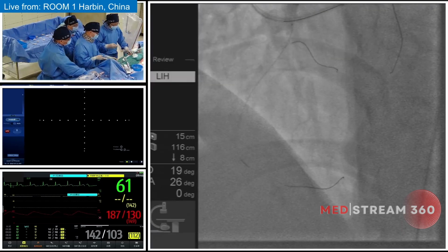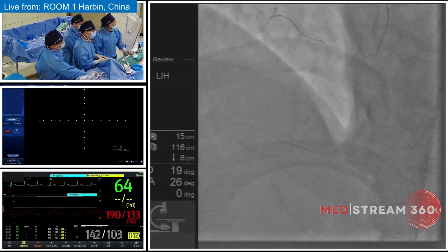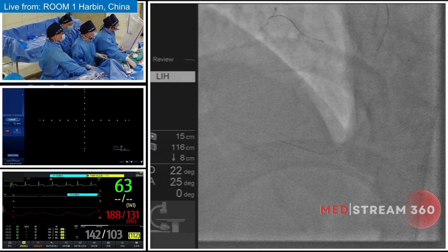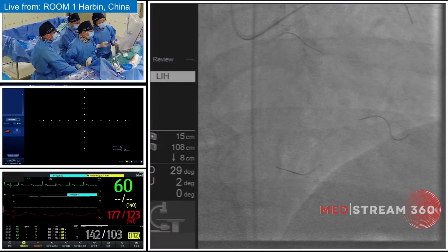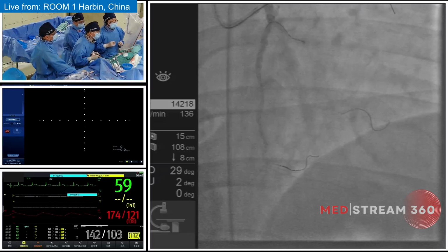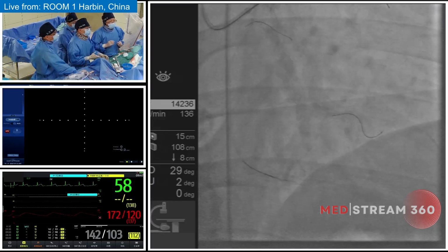Sometimes when we redo angiogram after 1 to 3 years, for some cases the vessel may even recanalize by itself. Even if it couldn't recanalize, it may increase the success rate next time. A previous manuscript indicated 70% successful recanalization after SPAM at follow-up of 2 to 3 months.